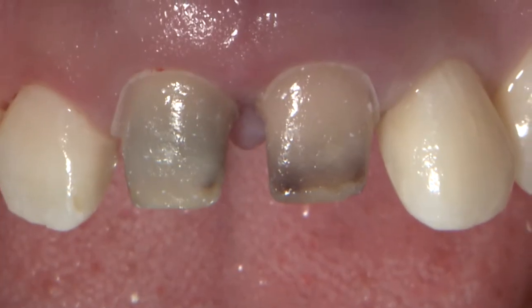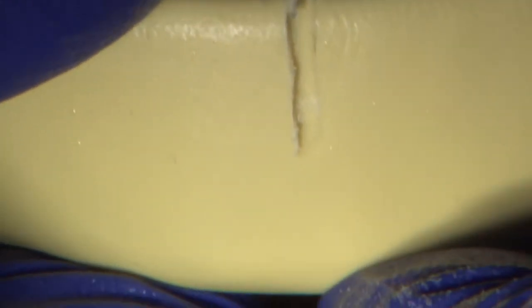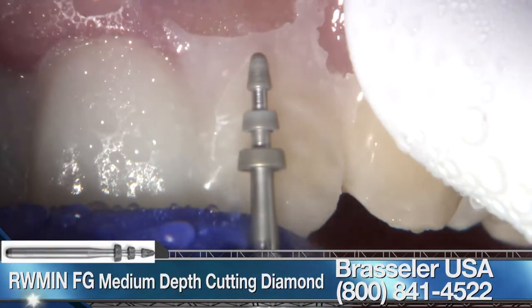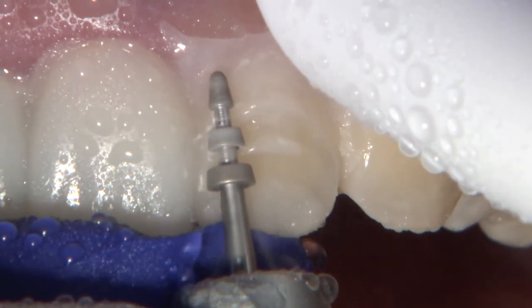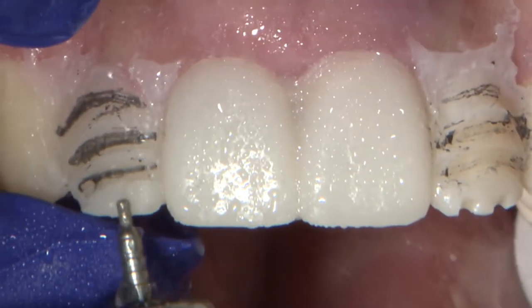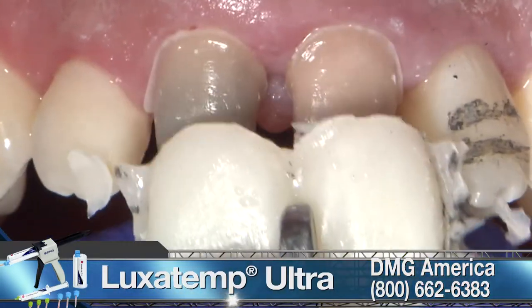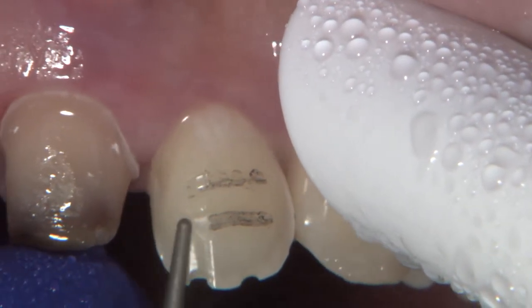To continue with the veneer preparation for 7 and 10, a snap-on matrix was created to serve as a guide for the depth reduction, as well as to give the patient the opportunity to re-approve his future smile. A calibrated depth cut burr from Brassler was used to cut through the matrix and obtain a 0.3 mm preparation finish line, a 0.5 mm reduction on the mid-facial third, and a 0.7 mm reduction on the incisal third. I also adjusted the incisal length of the matrix by 1.5 mm. After the removal of the Laksatempa acrylic matrix, I noticed the pencil marks were only present on the left lateral due to its labial flare.